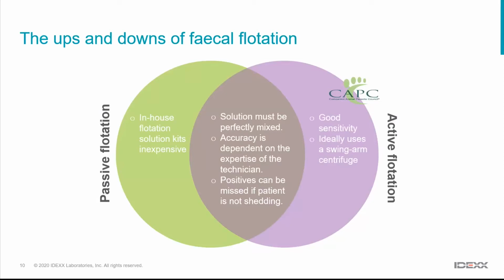And there's a group in the States called the Companion Animal Parasite Council. This is a group of veterinarians, parasitologists, human doctors, zoonotic disease people, medico-legal people, zoonotic experts, who get together and create recommendations for diagnosis and management of different parasites. And certainly the CAPC suggests that for flotation techniques, we're better off doing the flotation centrifugation technique.